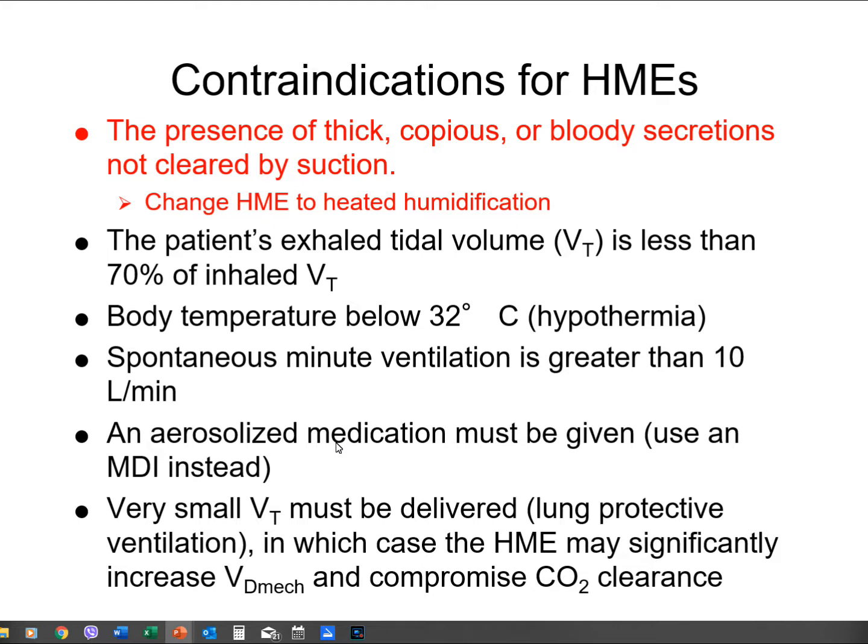Now, I wanted to show you guys, and I don't have it. I don't know what happened to it, but there was an HME where you can just rotate a certain part of it and it'll read aerosolized. And that means that you can keep the HME on, and when you twist it and it says aerosolized, then it will allow the medication to go through uninhibited, right? And then when you're done, you just turn the dial back and it'll say HME, and it's going to continue to heat up the air.